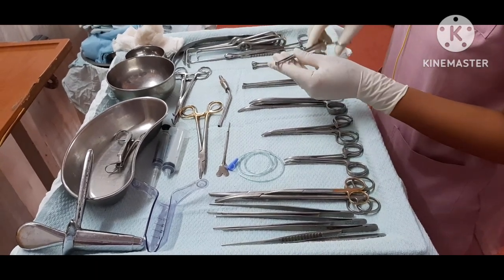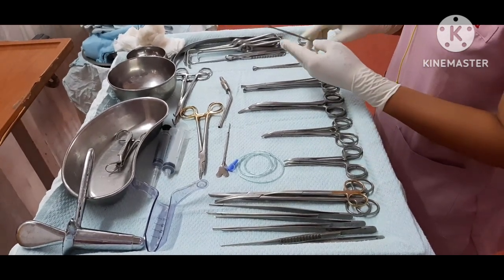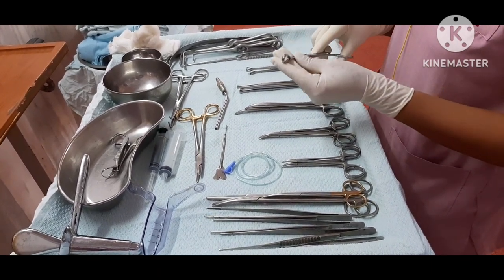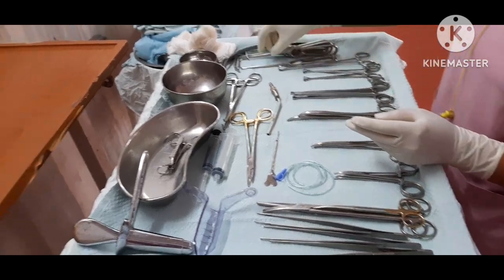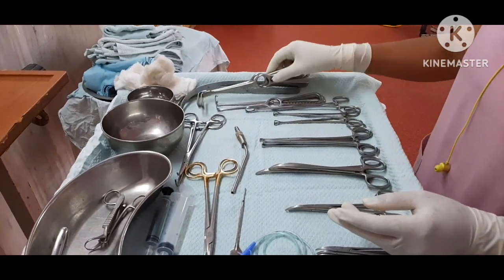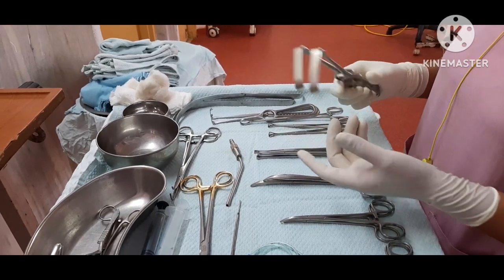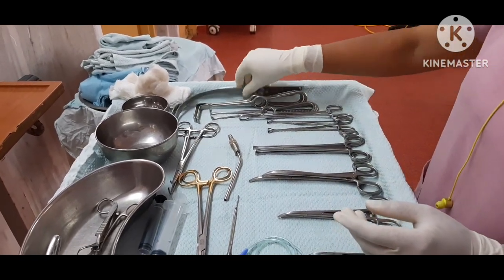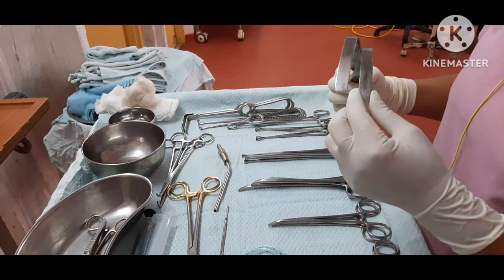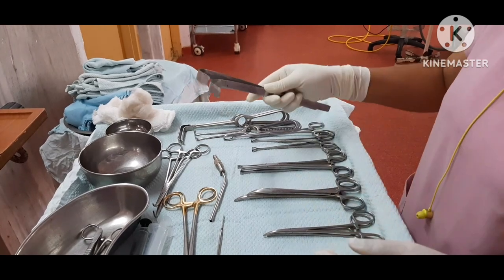Alice forceps — used to hold tissue. Babcock forceps — two Babcock forceps. Sponge holder forceps. Then Langenbeck retractor — used to retract the skin and tissues. This is also a Langenbeck retractor for retracting tissue and deep muscles. Its width is half inch so we can easily visualize with retraction.